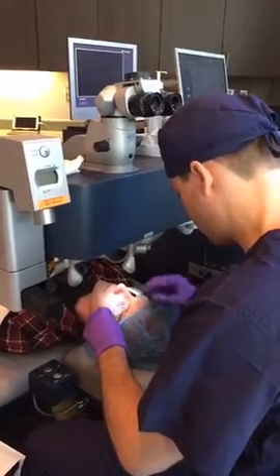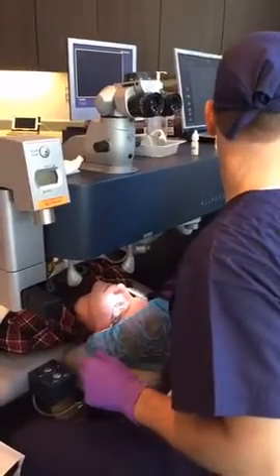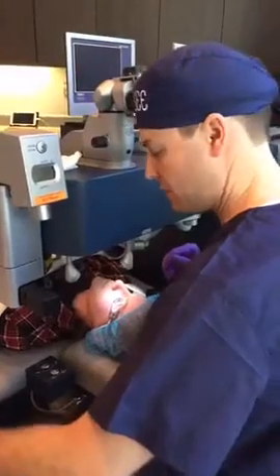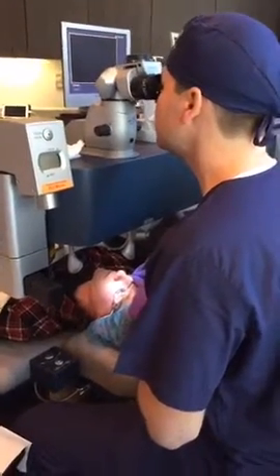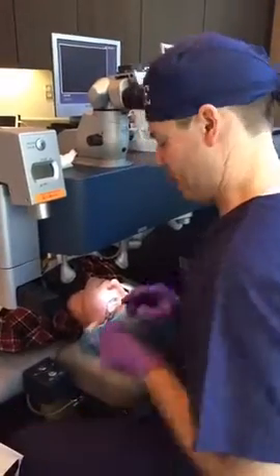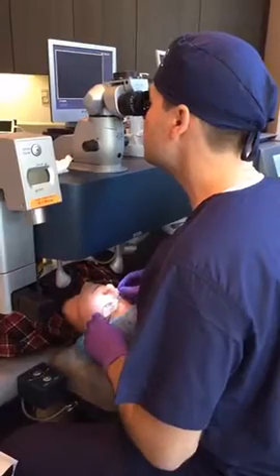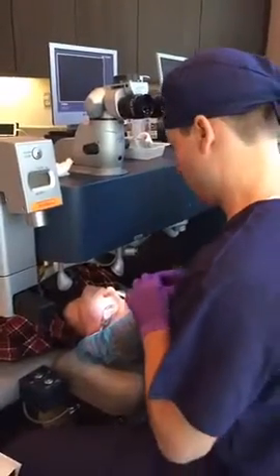Confirm OS. Halee OS, -2, -25 at 137. Thank you. Okay, so once again, just looking straight ahead at that green flashing light there. Okay, awesome. Great. So you can focus your attention toward the green light. You're going to feel a little tug and pull here.